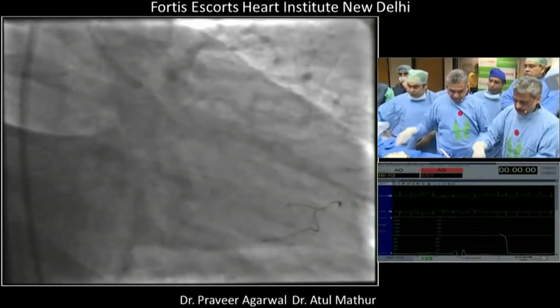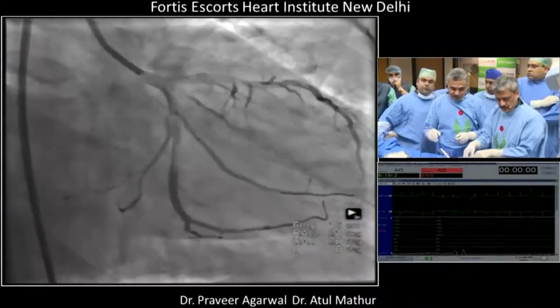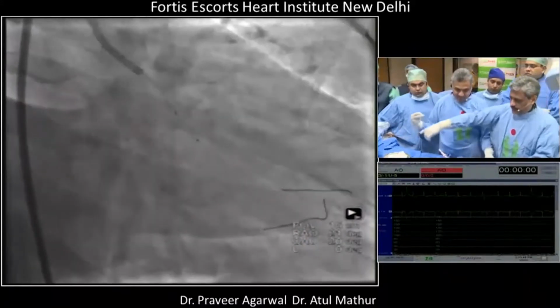You want to see a picture, or we do a dilatation for the circ? Yeah, just go dilate the circ. I try to save contrast in diabetic people, then IVUS. If you don't have imaging, then you can take multiple pictures. Yeah, he's a young guy.